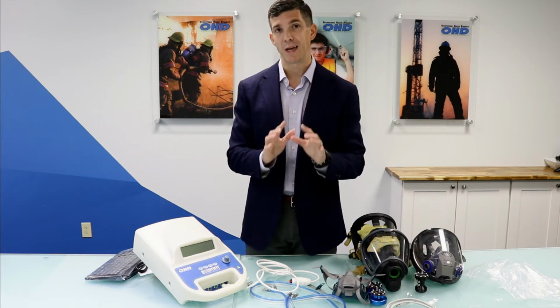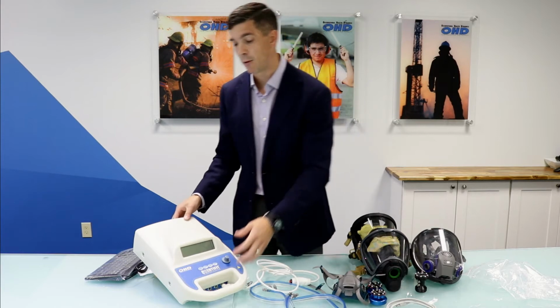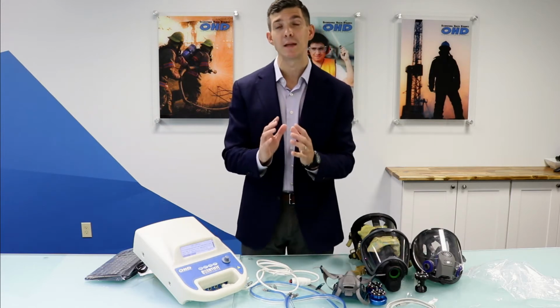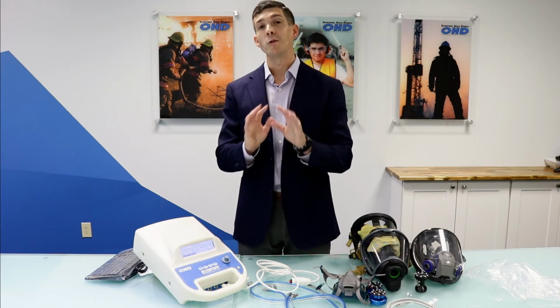So let's move into daily calibration. Once you have your unit connected up to power, you'll use your on-off button on the back. We should see the screen power up. And what it will do is it will immediately give us a recommendation to do a daily calibration. This is only on days of testing.